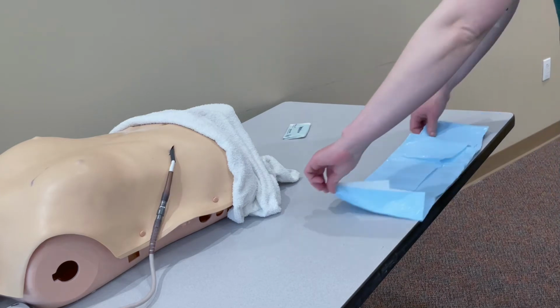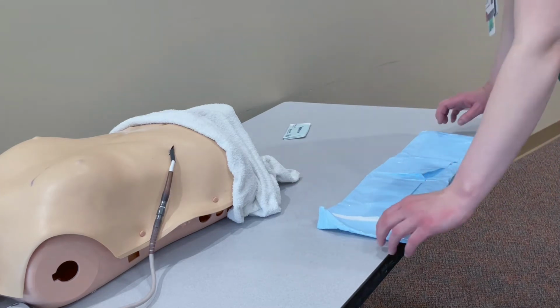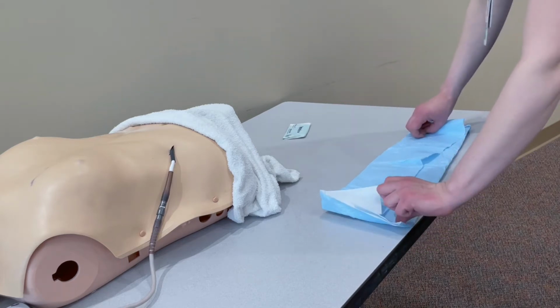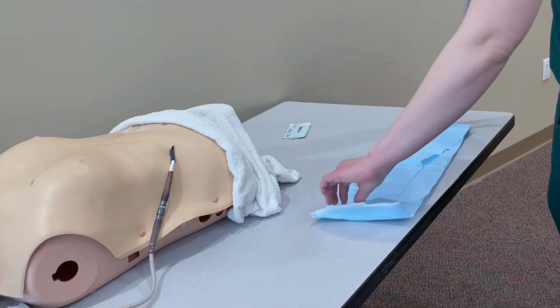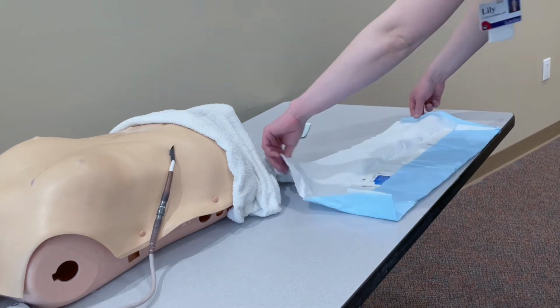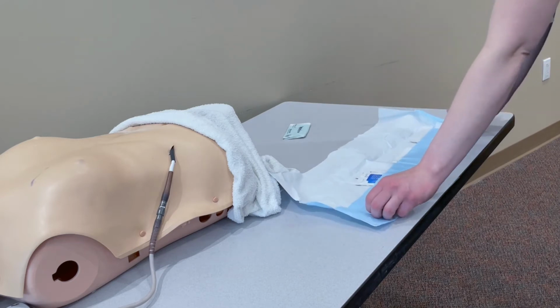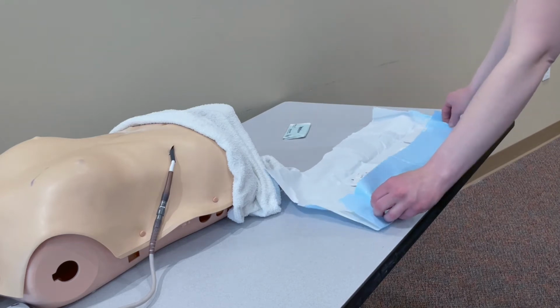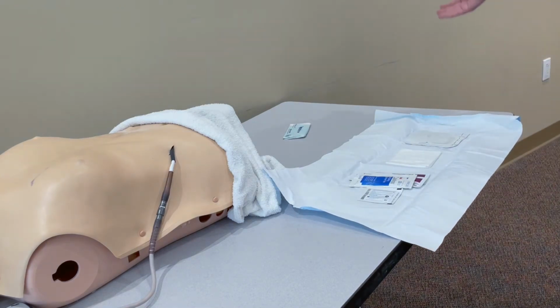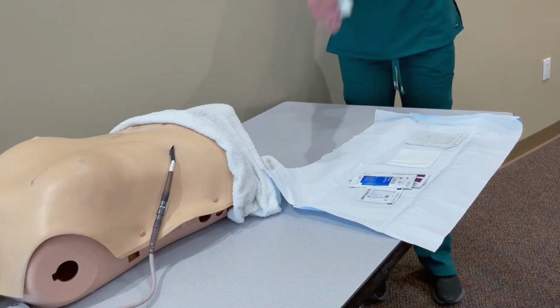You'll want to open your sterile field by only touching the blue. Anything in the white area is considered sterile, therefore should not touch anything other than your sterile gloves when we open that up. So pinching the blue to open this, and pinching the blue to open this. You'll want a nice clean surface area to set up your sterile field on. Once that is set up, you can go ahead and move over to your sterile glove.